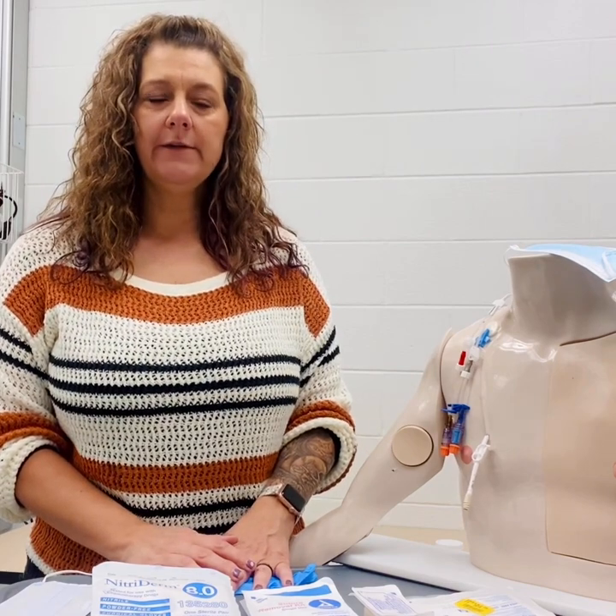As always, when you enter a patient's room, you want to introduce yourself and identify the patient using two types of identifiers. We always explain the procedure to the patient and provide for privacy.